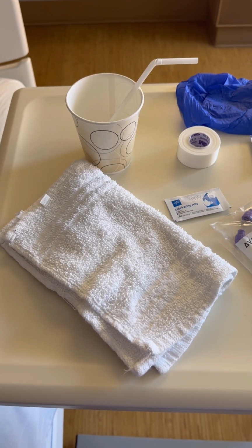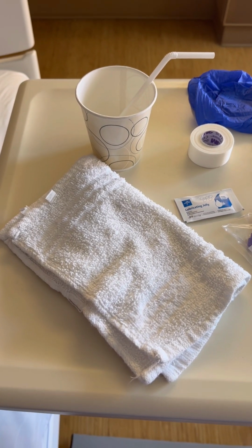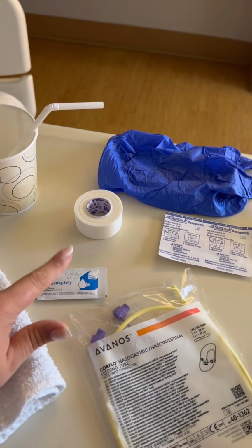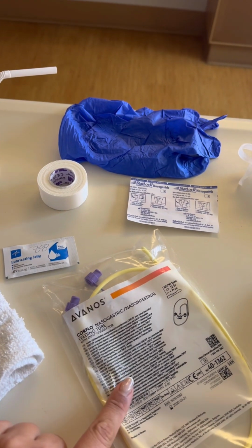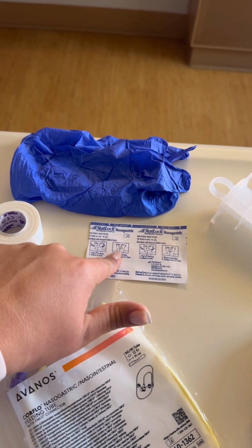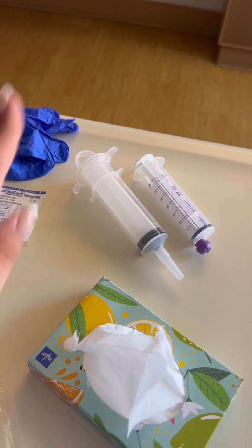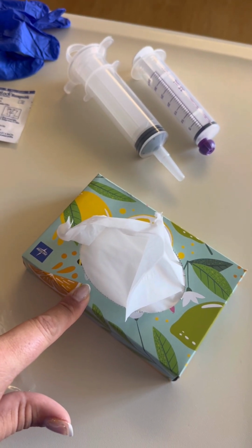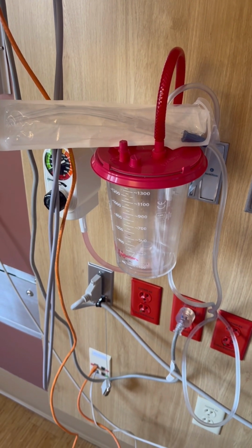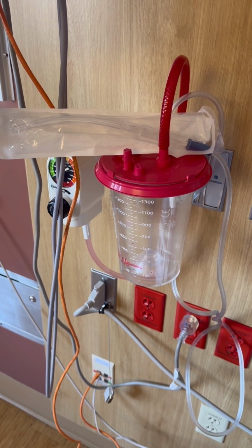In order to perform this skill, you should have all necessary equipment ready. You should have a towel, a cup with water and a straw, lubricating jelly, the NG tube, tape for marking, a fastening device, gloves, a piston, and tissues for your patient. You should also have suction set up and ready in the room in case your patient were to start vomiting or bleeding excessively during insertion.